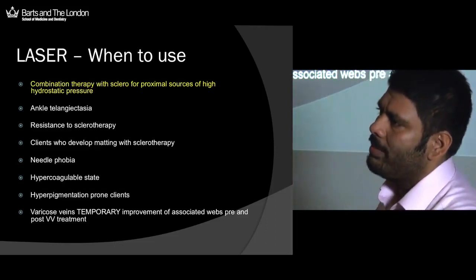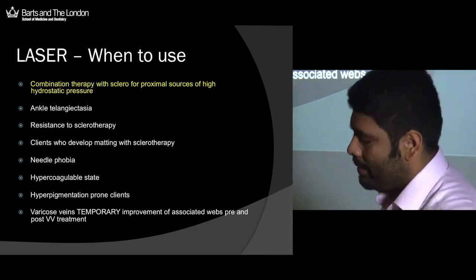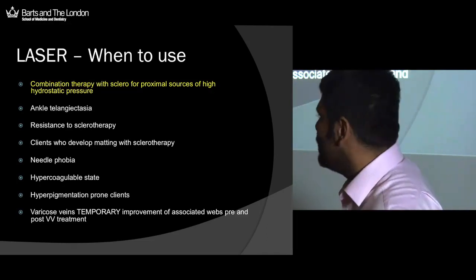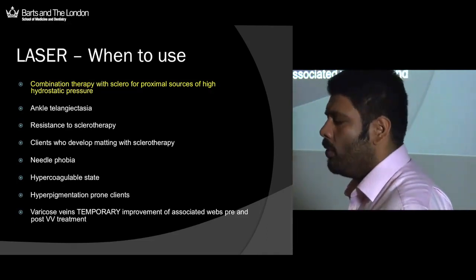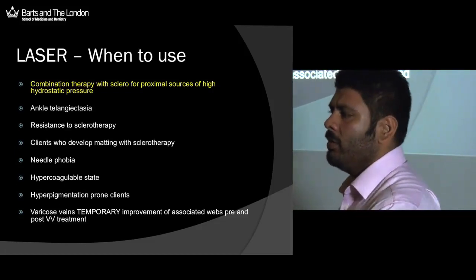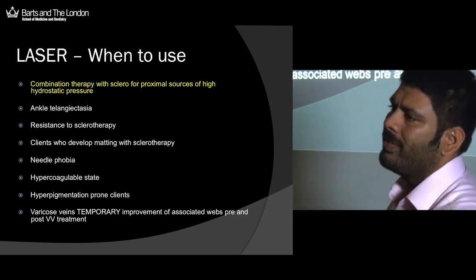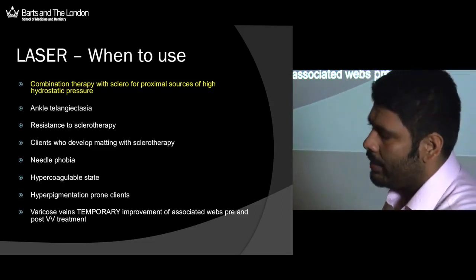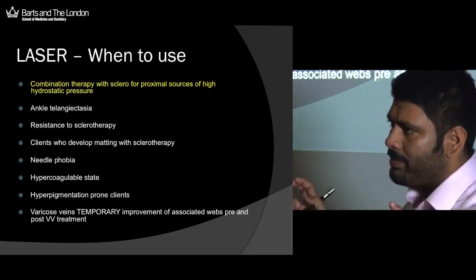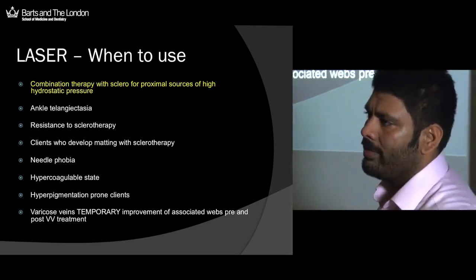Leg telangiectasia, by definition, are deeper, over 1 millimeter deep, and 400 to 600 nanometer wavelengths don't adequately penetrate, and all they cause is a superficial vasculitic purpura, which then just goes on to cause hyperpigmentation. I've seen this so often, pulse dye laser, KTP laser, used in the treatment of leg veins, because it's just generally accepted that those are vascular lasers, so they ought to work on the legs as well.